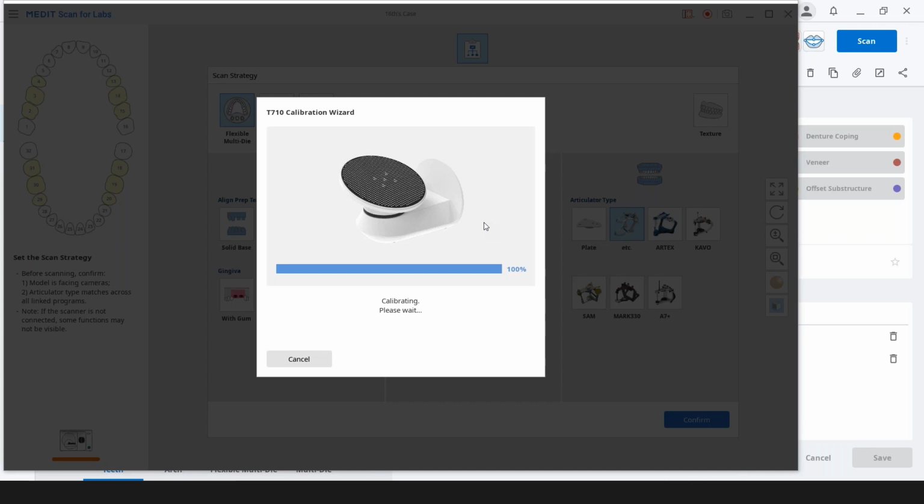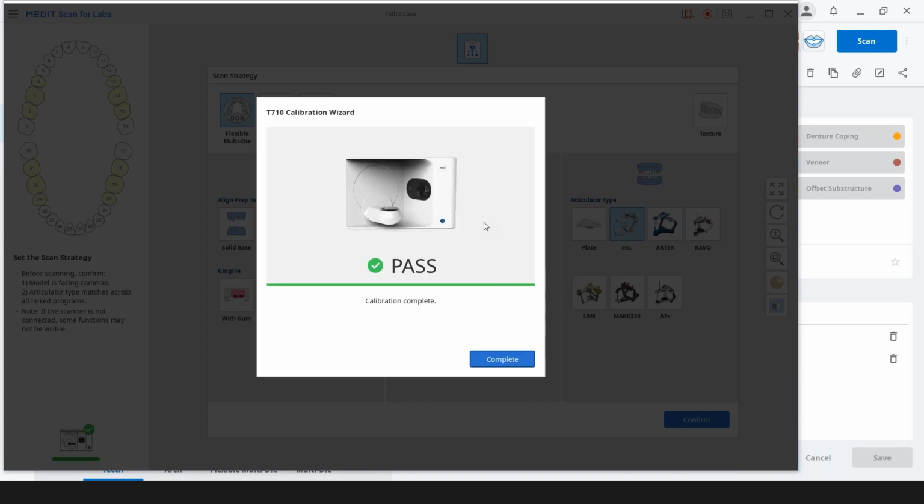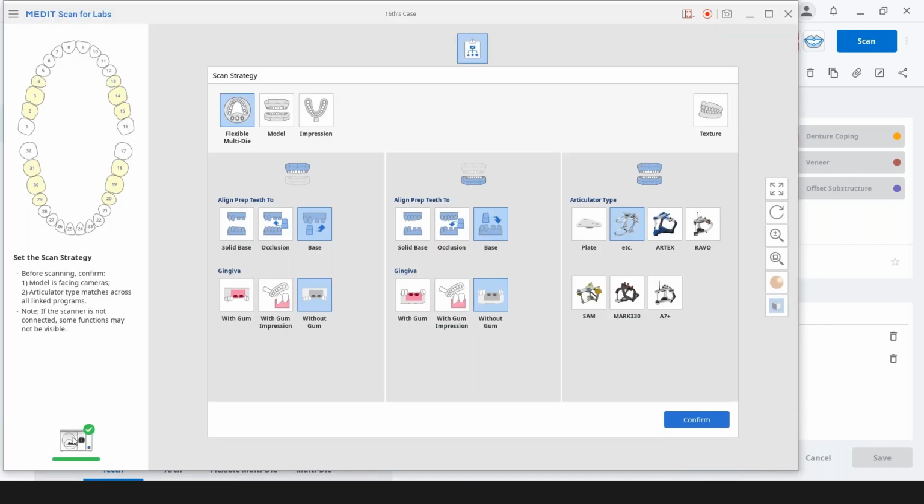It's at 100% now, so it'll just calculate and then flash up hopefully an OK. There we go, so we passed. You can see the passed in the middle there. We'll just say complete. And now if you notice down here, it has turned to a green color, and that's a good sign.